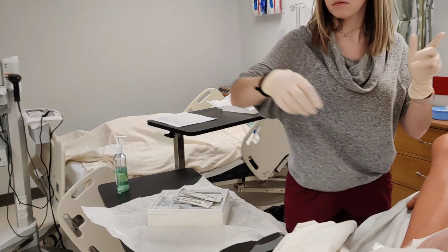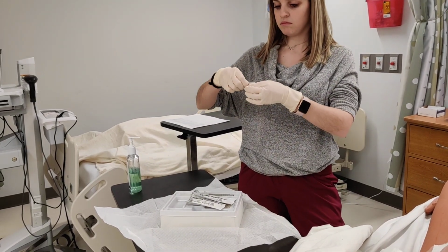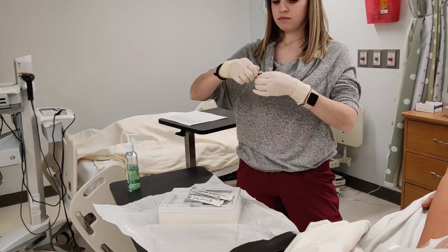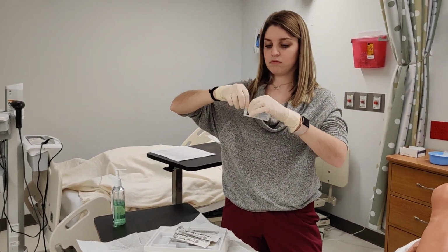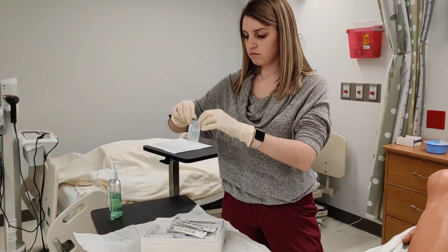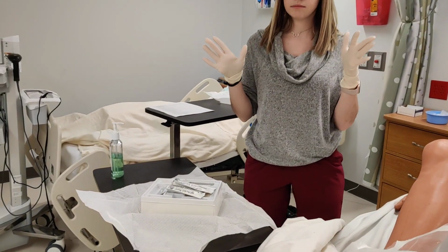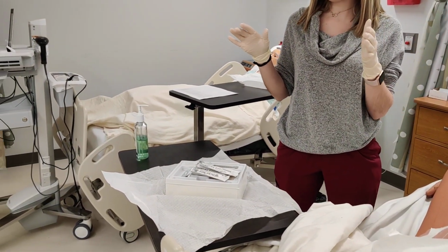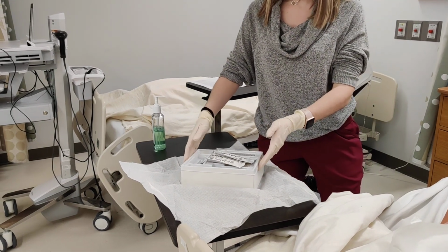Also in your kit, aside from those packets of swab sticks, her kit actually has 2 packages. Most kits have only 1 package. She's opening the lubricant that comes with the kit. All right, so once that's done, she can separate the top portion of that container from the bottom.